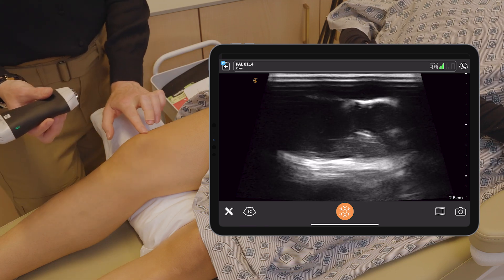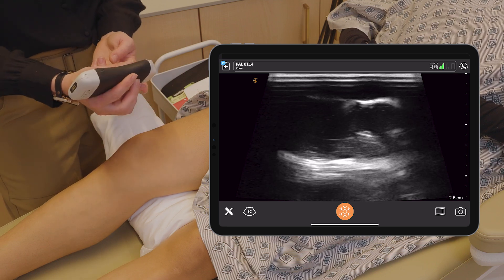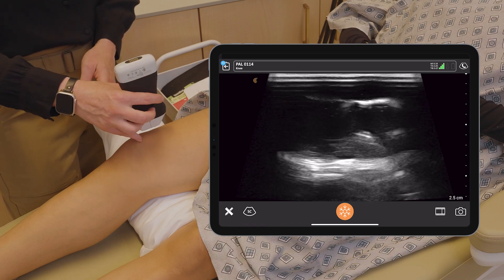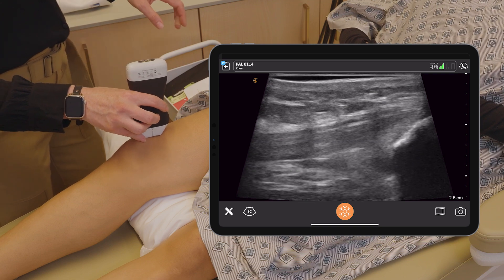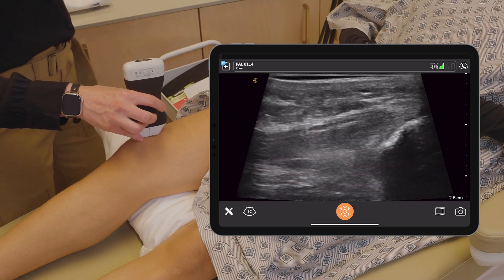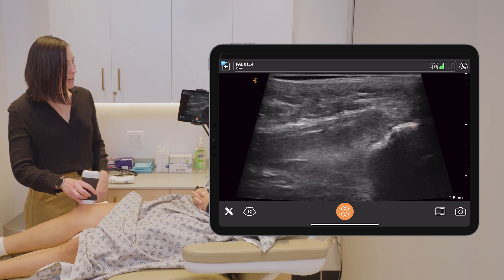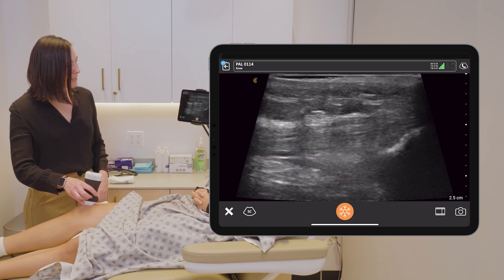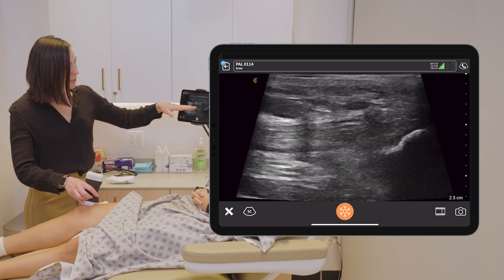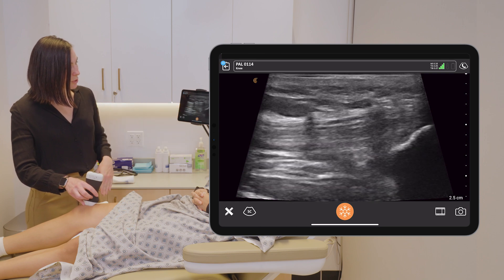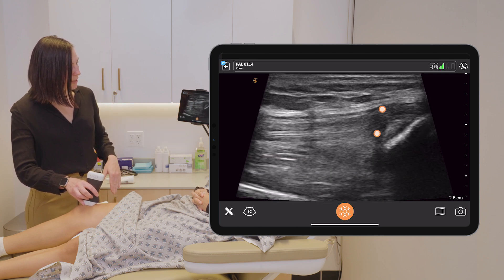I'm going to identify the patella, the edge of the patella, and that's where I'm going to put the bottom of my probe. On the right side of the screen, we can see the patella with a deep shadow beneath it, and the horizontal striations — this is actually the quadricep tendon, which you can visualize really well.